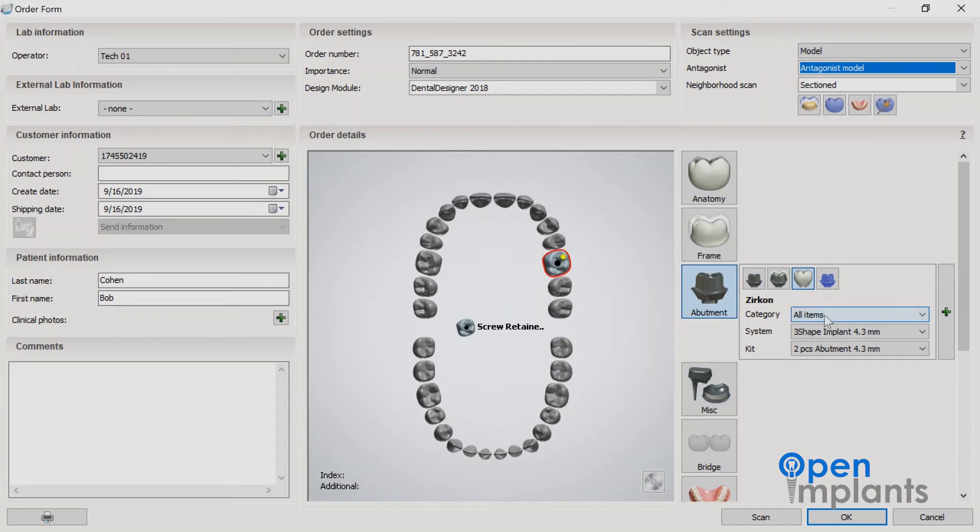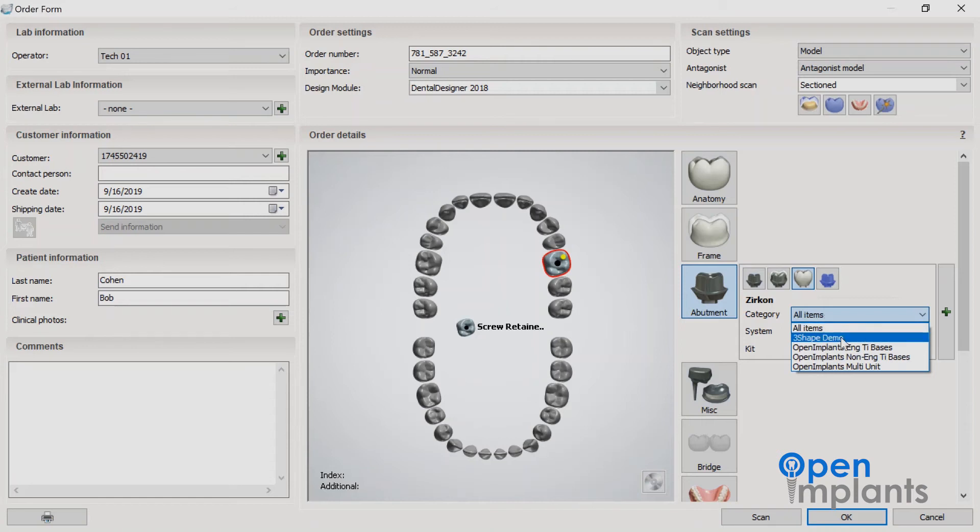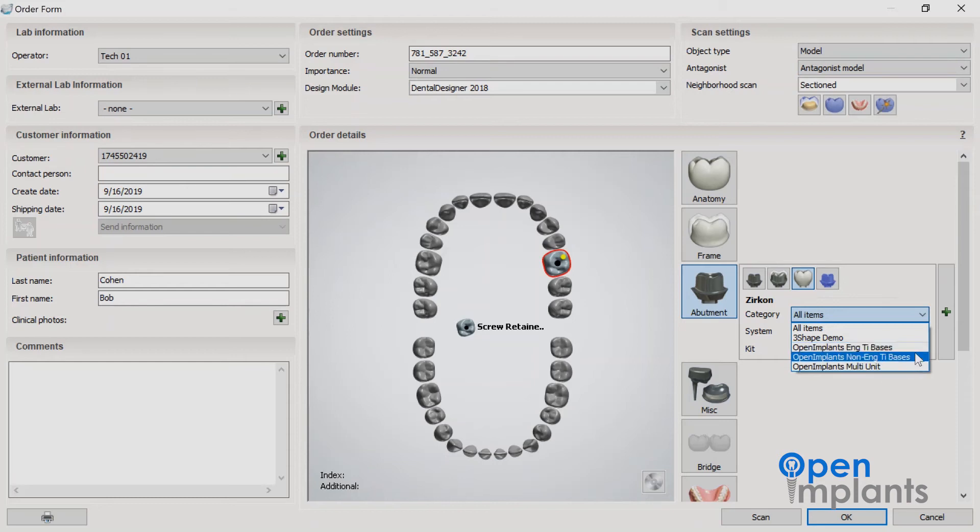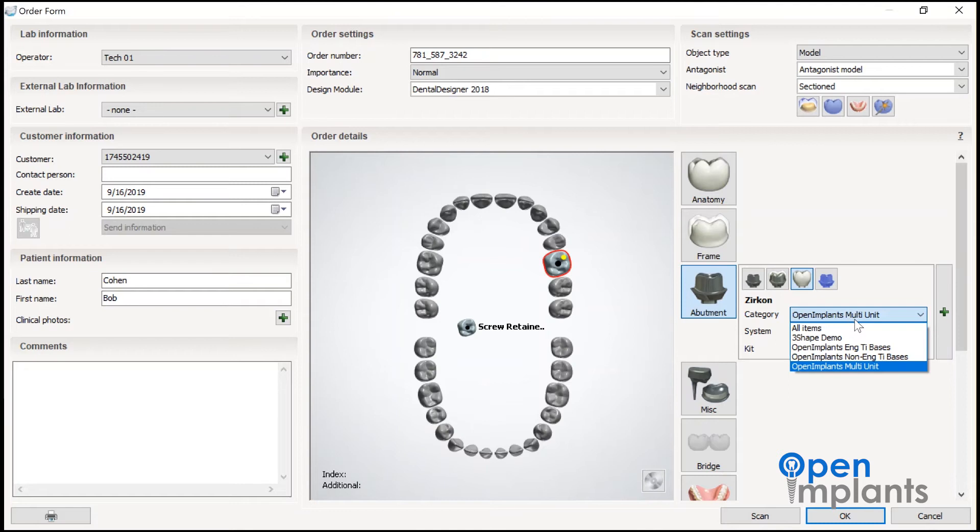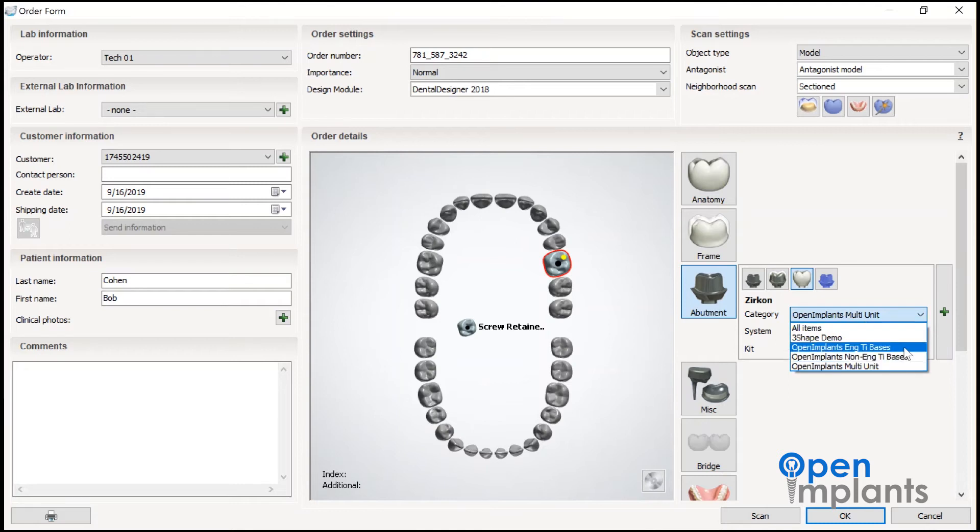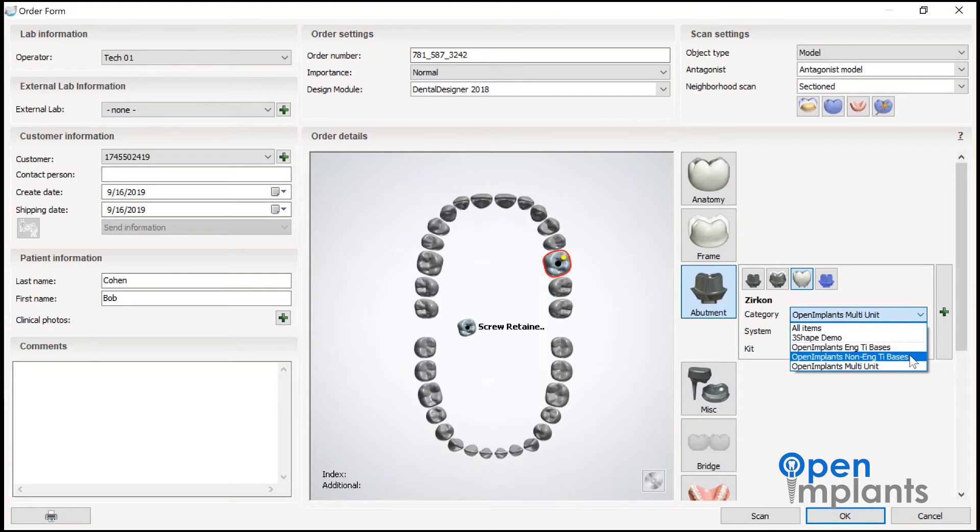You're going to drop down the menu and you'll notice there's a few different types of open implant libraries there. Open implants engaging titanium bases are used for single units. The non-engaging bases are used for bridges and the multi-units are for multi-unit types such as Nobel.